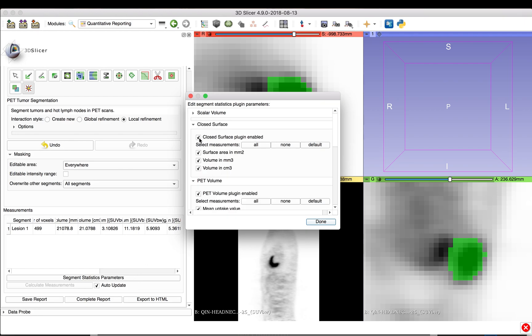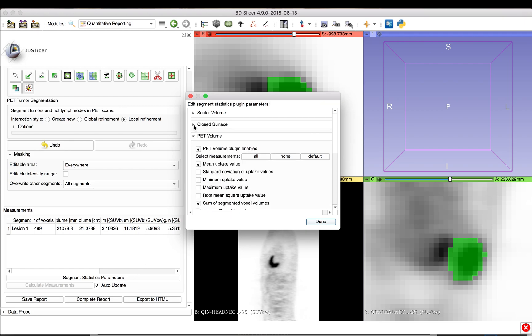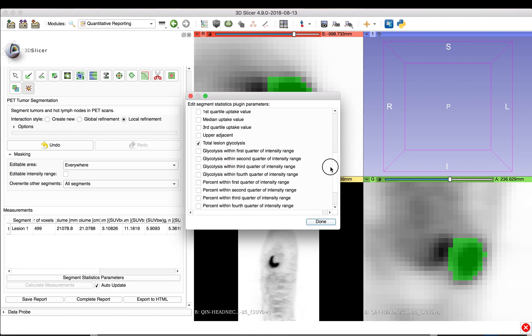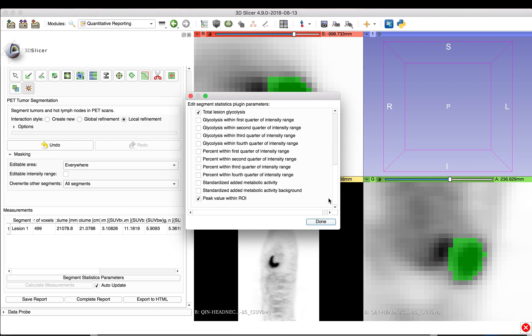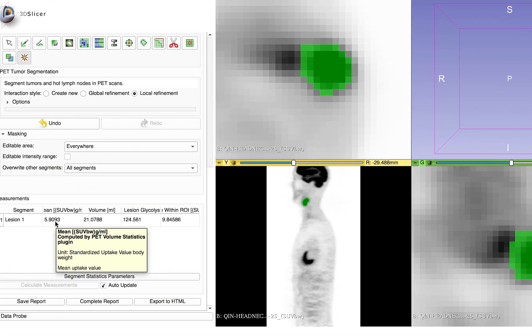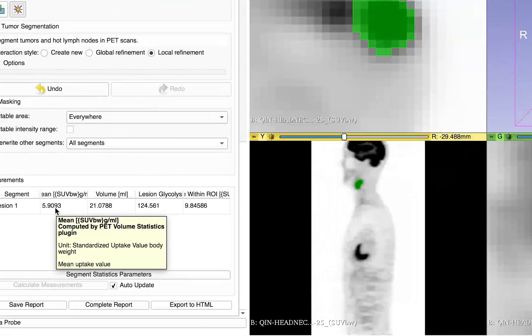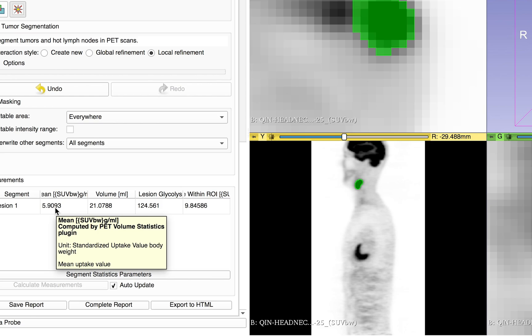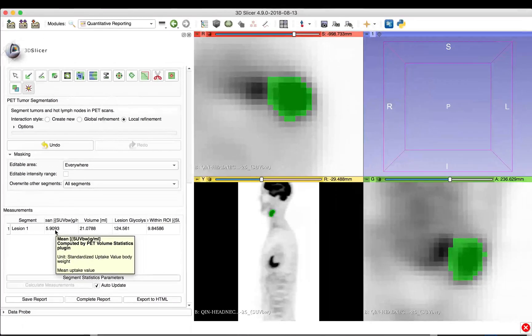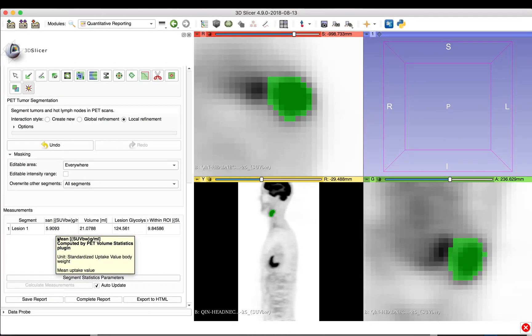In this example, we are only interested in PET-related measurements, and so disable all other segment statistic plugins. By hovering over a specific measurement value, more detailed information about the related measurement is displayed. The first measurement value in the list, for example, is the Mean Uptake Value in Standardized Uptake Value Body Weight.